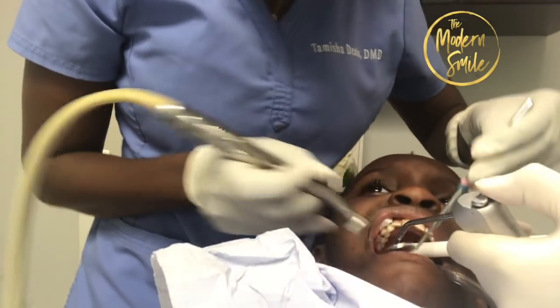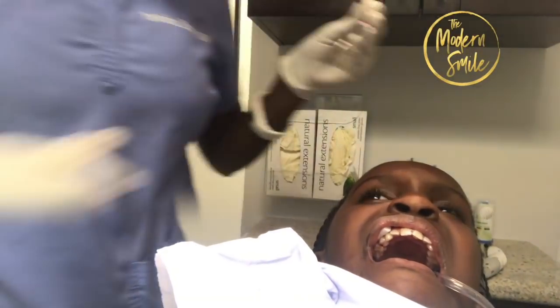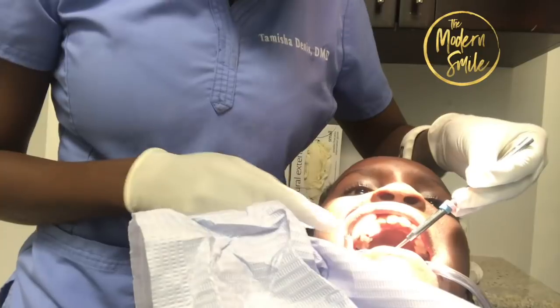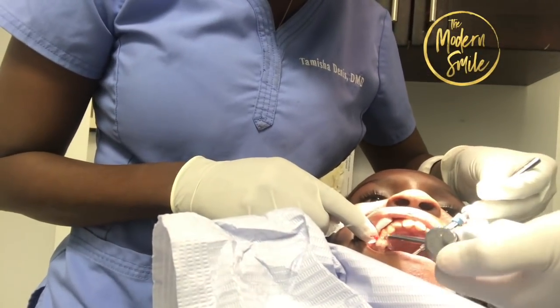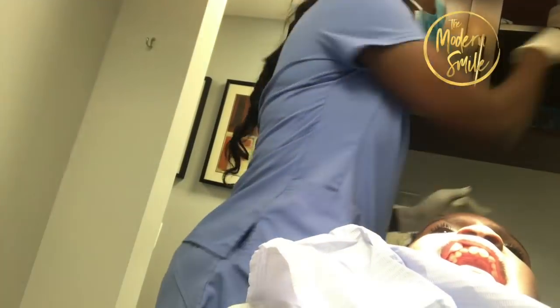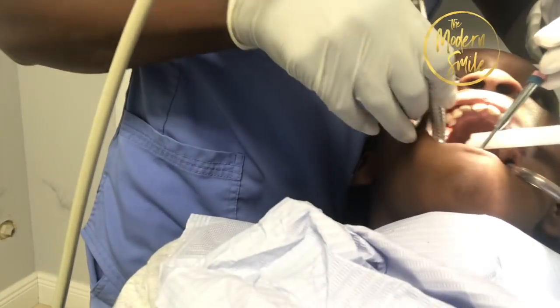A little? Okay, I'm almost done. Hold on. So the next part you're going to see is I'm still doing a little bit more drilling. With kids, I try to be as quick as possible. It's really important to get in and out of there before they lose their patience and want to get out of the chair. Kids don't have as much patience in the dental chair as adults do.